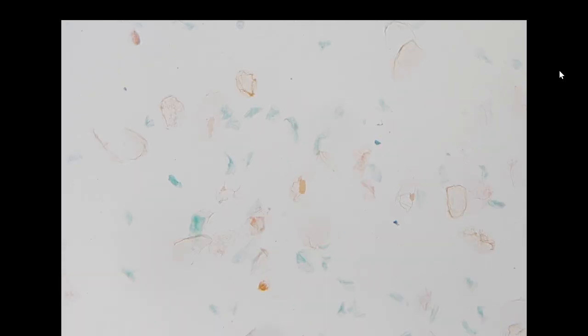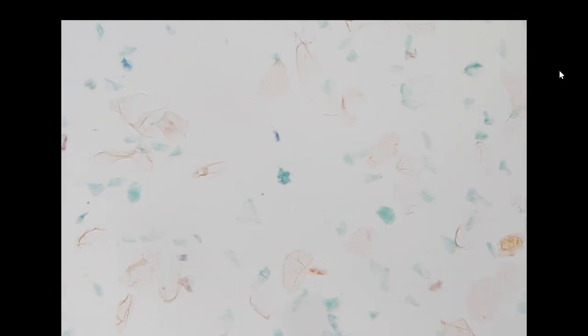So this is also something that we will see in the head and neck region. Sometimes we will just see this very bland looking squamous cystic lesion, and we need to make some determination. So based on the clinical impression in the CT report, they say it could be metastasis, but she's only 31 years old, and it could be coming from a second branchial cleft pouch, developing a branchial cleft cyst.